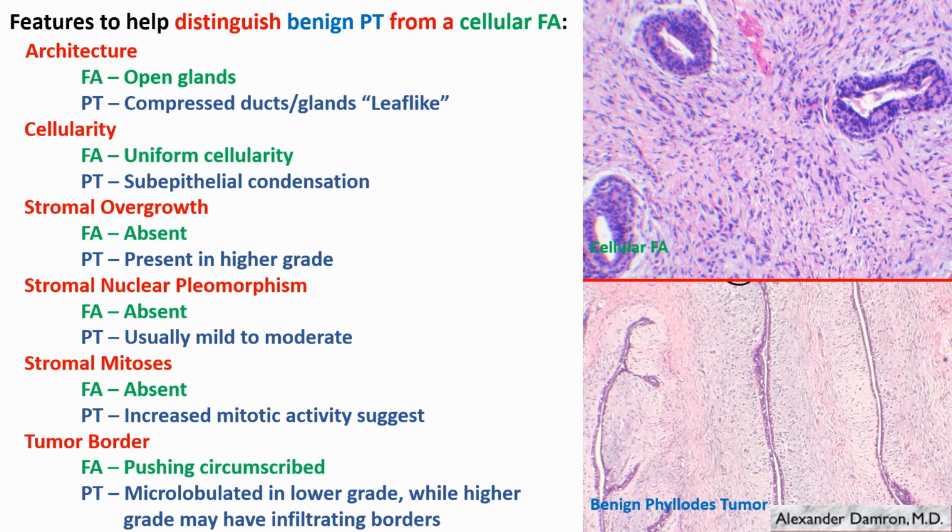You have this kind of bumpy surface, and on radiology it may be like an irregular mass. You're going to have those kind of terminologies. They'll say micro or macro lobulated mass. Those are the kind of terminology words you want to look for in the radiologic description. And again, you may or may not see that histologically depending on if the edge of the lesion was sampled in the core biopsy or not.